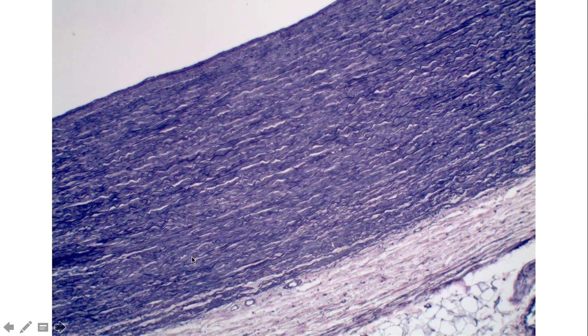This slide is of the elastic artery. So the only example we have in lab is of the aorta. So the elastic arteries, these are the biggest arteries that we have. So the pulmonary arteries and the aorta are two good examples of elastic arteries in our body. And the big difference, and hopefully you can notice this here, is that the elastic tissue, or those elastic fibers that were confined to the internal and external elastic lamina in the muscular arteries, are now found throughout the entire tunica media. And so in this example, here's the lumen.